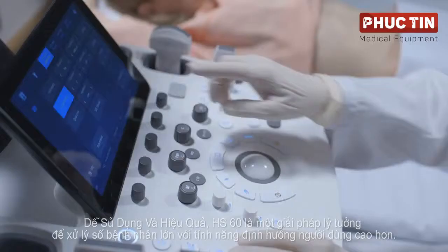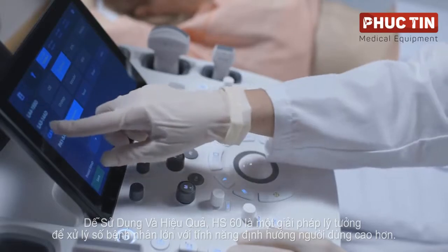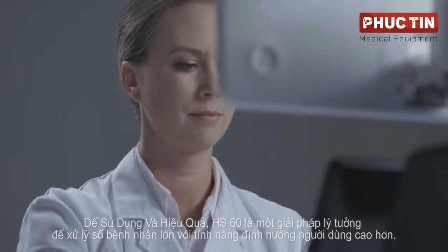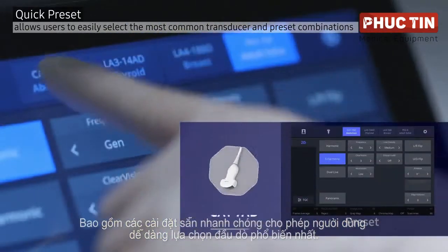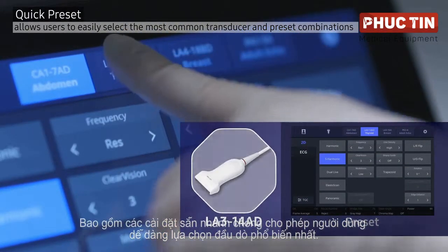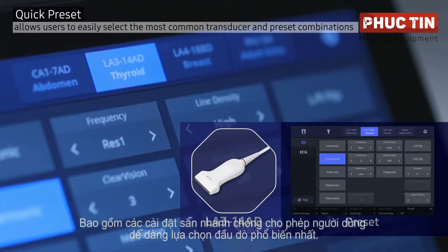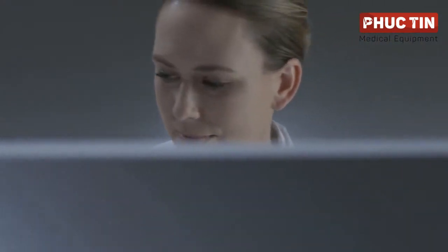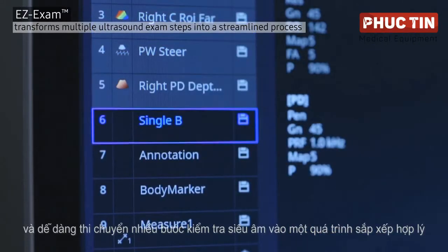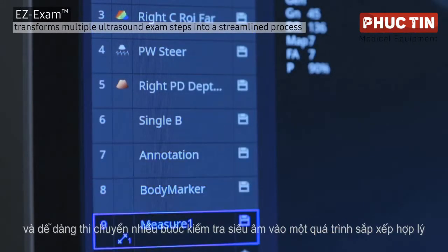Easy to use and efficient, the Hs60 is an ideal solution for handling a higher number of patients with user-oriented features, including quick presets allowing users to easily select the most common transducer and preset combinations, and Easy Exam, transforming multiple ultrasound examination steps into a streamlined process.